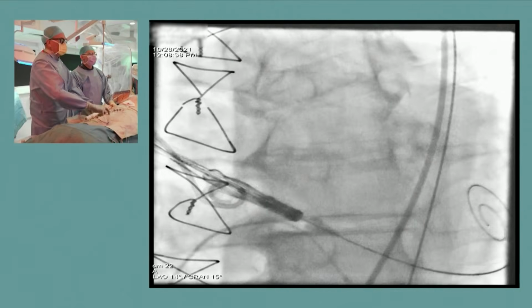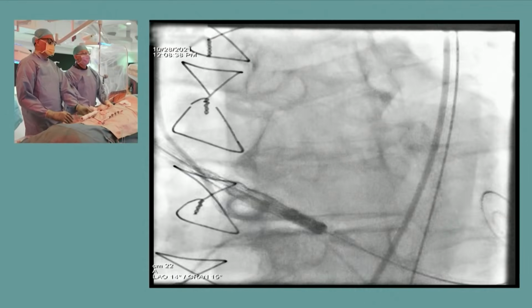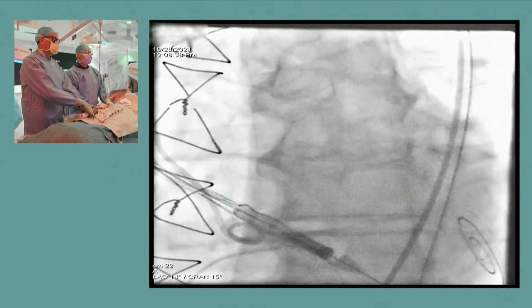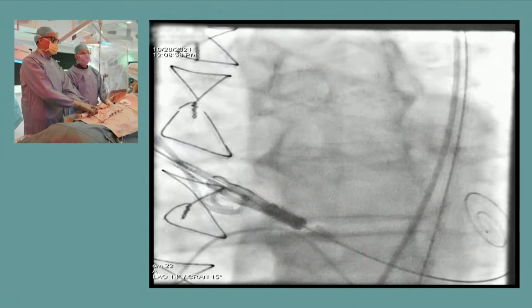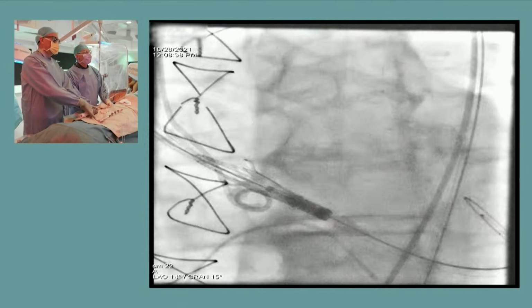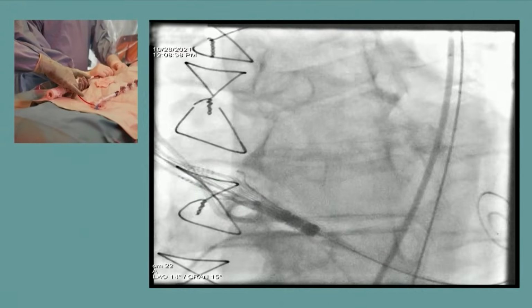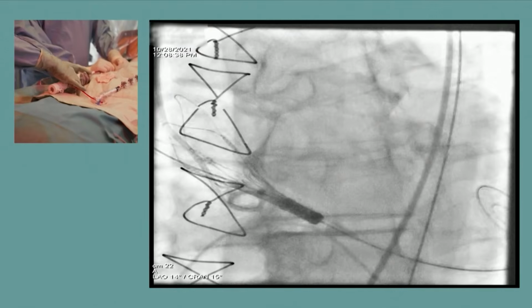Okay, so for NEO2, they have a radiopaque marker. You put that so it lies just on top of the cusp, and you have to have a forward motion. Not typically a lot of forward pressure, but you want to make sure you're on the outer curvature, and then you start turning the 1 knob into 1A configuration. You open up the first part of it, and you want to make sure that these upper crowns stay on top of the leaflets. So it's a very slow, deliberate process, and hemodynamics is good throughout.